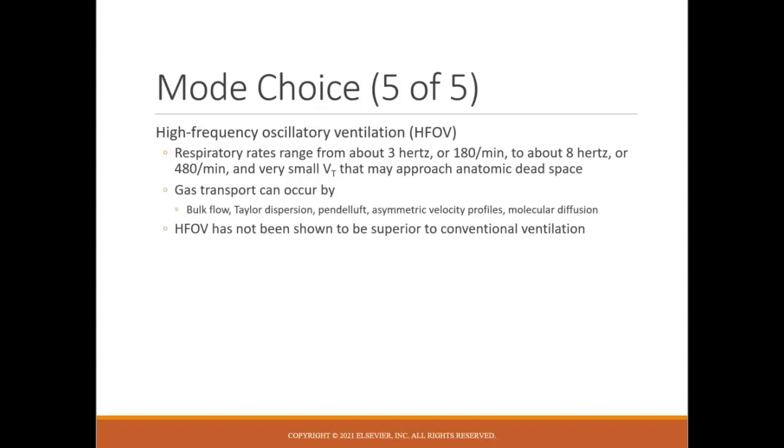High frequency includes oscillatory ventilation, which we use a lot in RDS infants, but there's also high frequency jet ventilation. This has been shown to be pretty effective in large air leak situations like pneumothoraxes, or when trying to ventilate lungs that have big leaks in them.